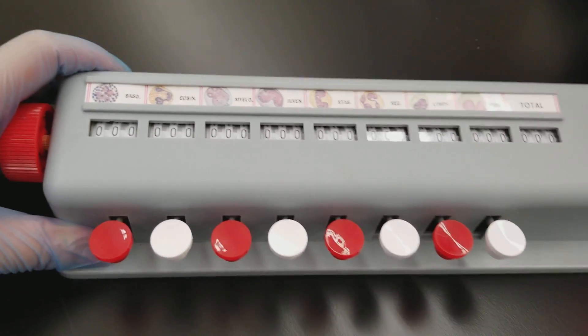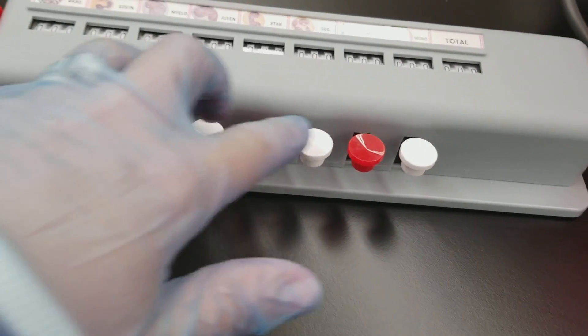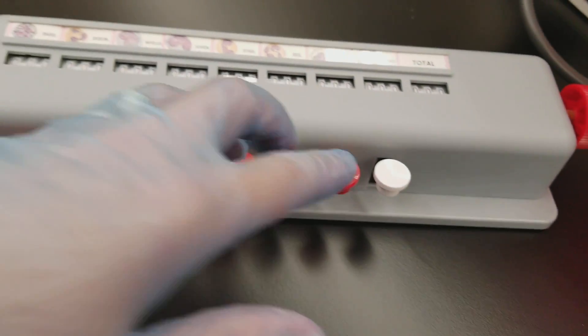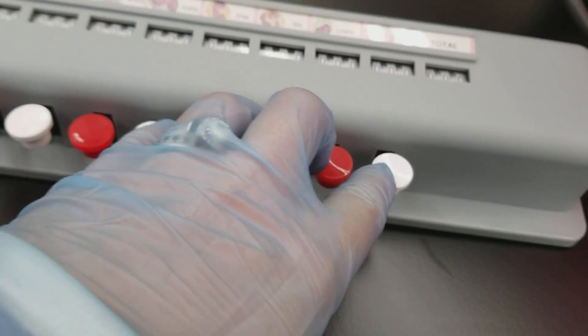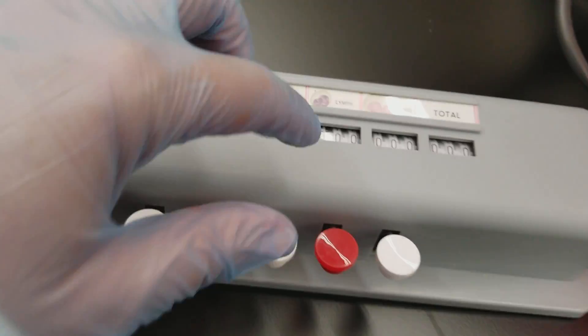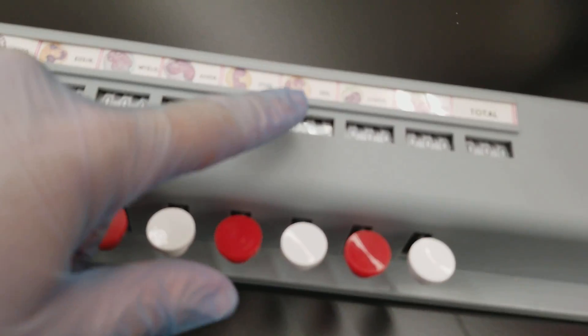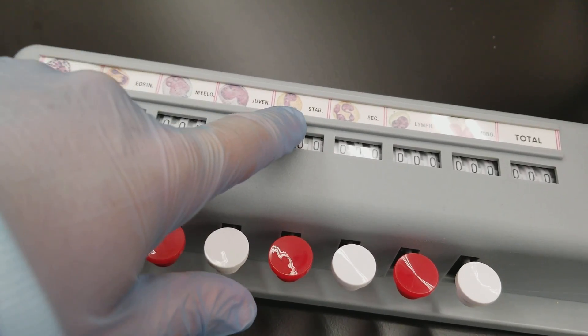So when we do this, we'll be on the microscope. Mainly you're over here because you'll see monocytes, you'll see lymphocytes, segmented neutrophils, and you'll have some bands.